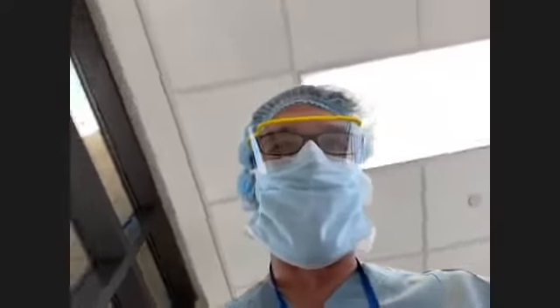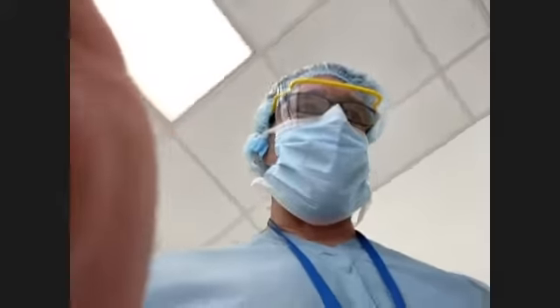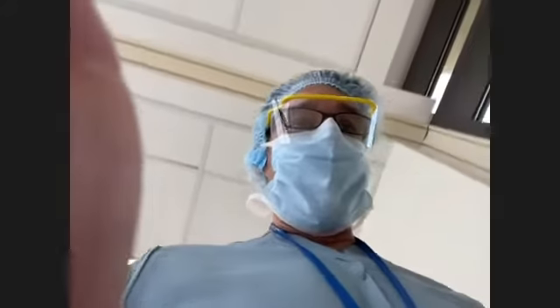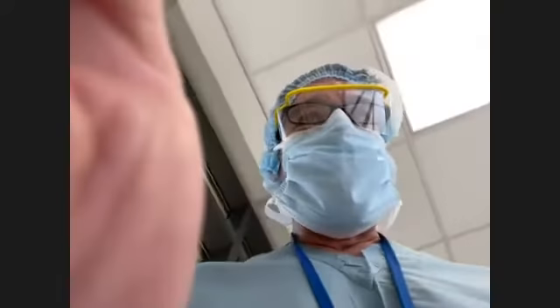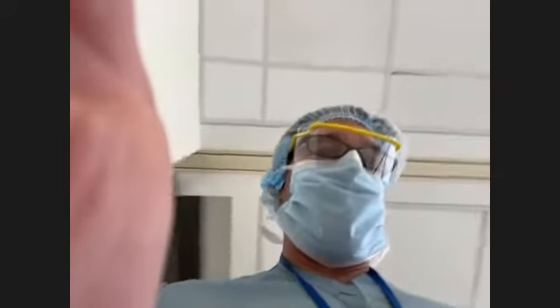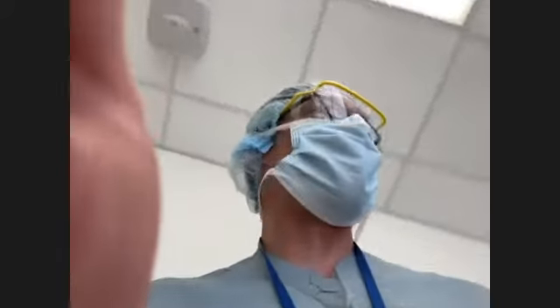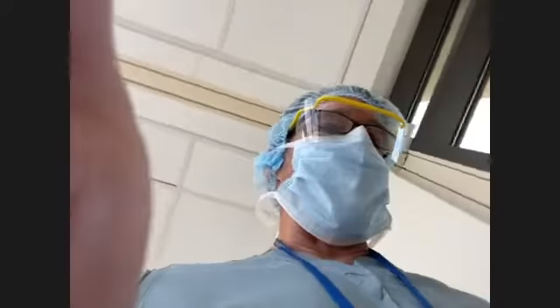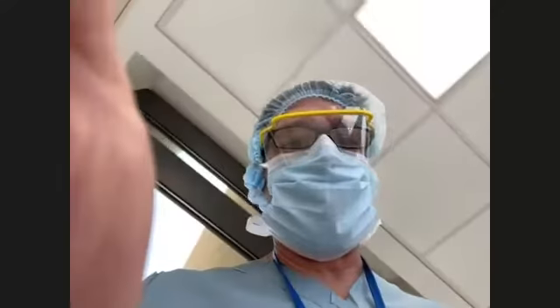So basically a patient cleans their colon out with a bowel prep, which involves taking things to make you poop a whole bunch over the course of several hours. And then come in and have a video with the colonoscope itself inserted. The colonoscope is a camera unit that has a light, as well as a camera, as well as something to insufflate to fill the colon with air, as well as a channel for inserting tools or for suctioning out things. So if there's a little bit of stool or some liquid, you can suction it out.